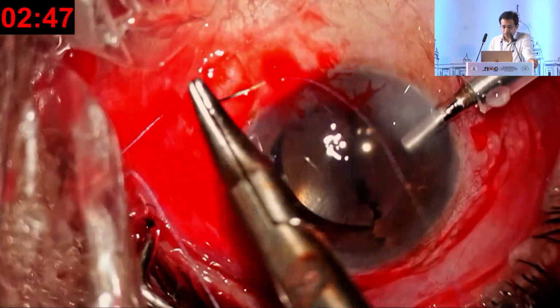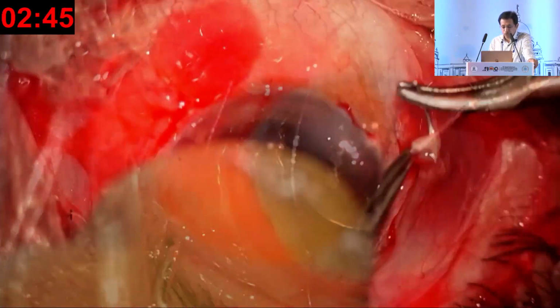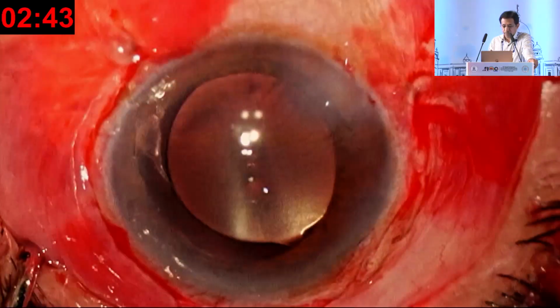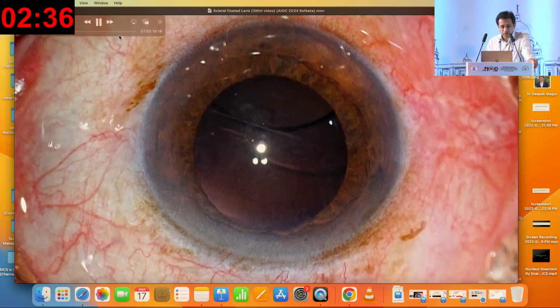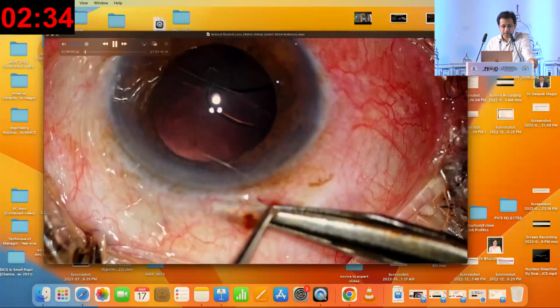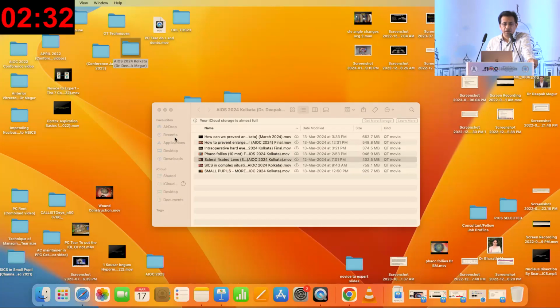People who have done a pars plana vitrectomy obviously use a pars plana infusion source. For anterior segment surgeons like us, that is what we use. And that was it. The conjunctiva is closed. That's it. So it is a reasonable choice. The sutured scleral fixation is also a reasonable choice when you're faced with explanting a PMMA lens, so we are forced to make a bigger incision. Otherwise, you can always resort to the newer techniques where you can manage through a smaller incision, like Yamane or the CMT flex. So that was it. Thank you for the opportunity.